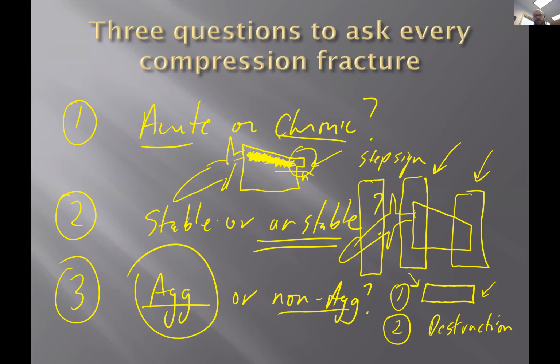Okay. And I'll draw it up there, it has more of this kind of an appearance when it's osteoporosis. Okay. It has more of this kind of an appearance if it's pathologic from metastatic disease. Thank you. Good question. Any other questions on this?